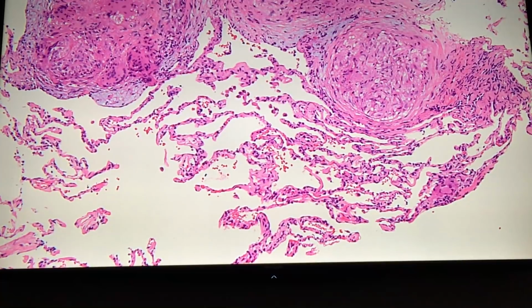itself. What they want to really exclude when they do this is to make sure they don't have lymphoma, because that's the other thing that can look exactly like that. Young person, bilateral hilar adenopathy. But in terms of other mimics, there are few things that look exactly like that clinically. So you're in good shape when you have a granuloma. But the better, more classic it is, the more you have confidence that it is sarcoidosis.